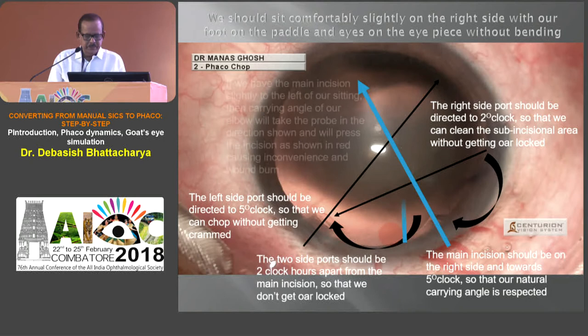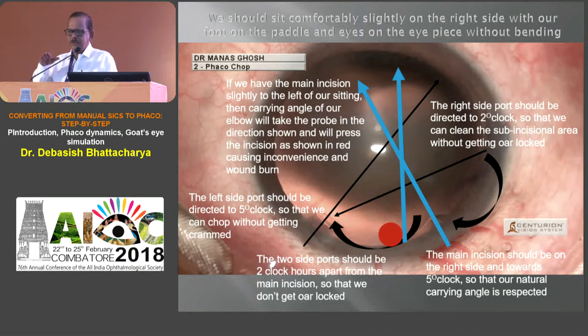If the incision is not positioned correctly — suppose it's directly ahead of you — when you're doing the FACO trenching, that part of the FACO probe is touching your incision more, so you can actually damage the incision and even cause a wound burn.